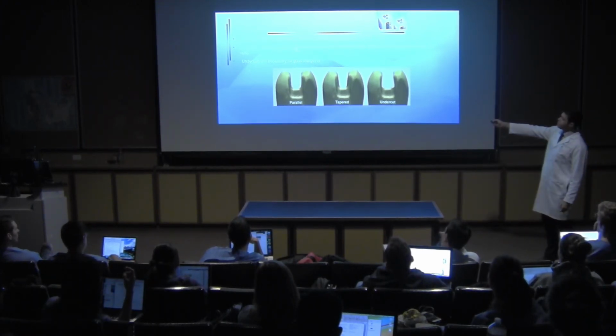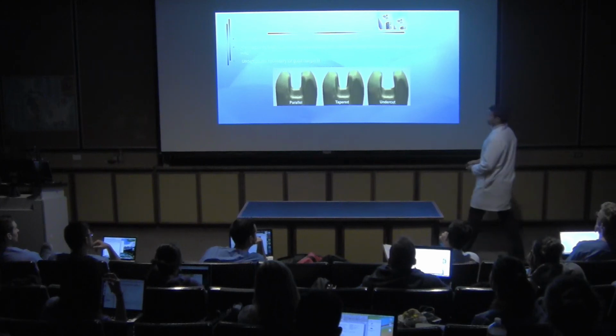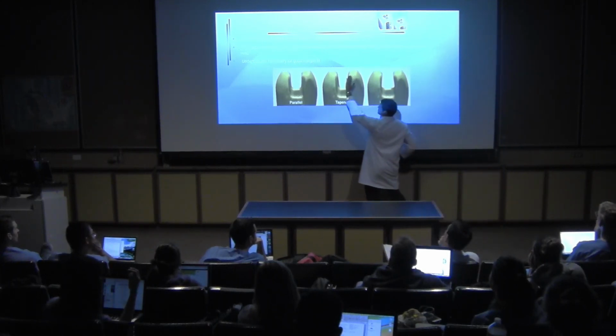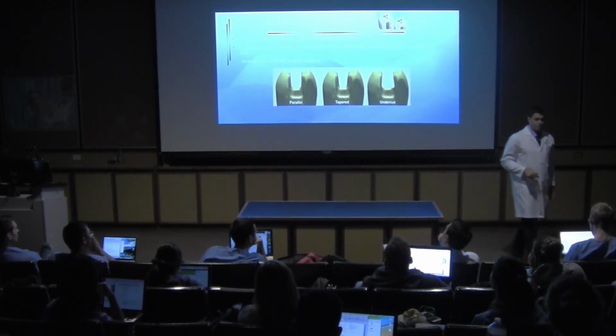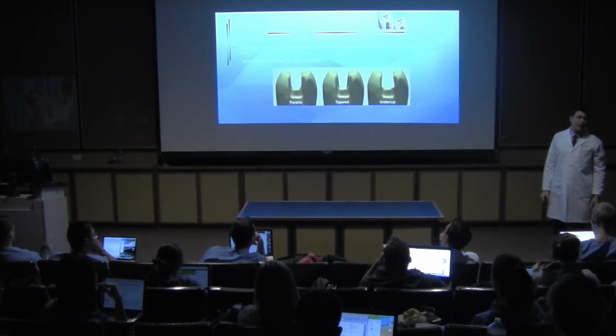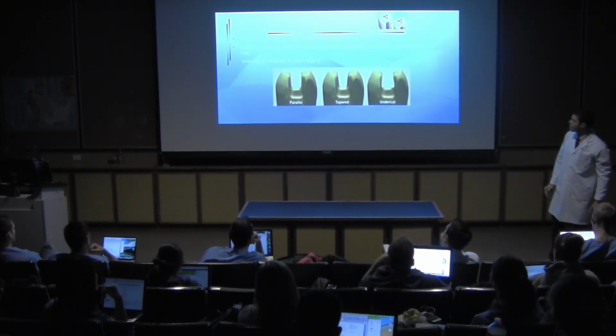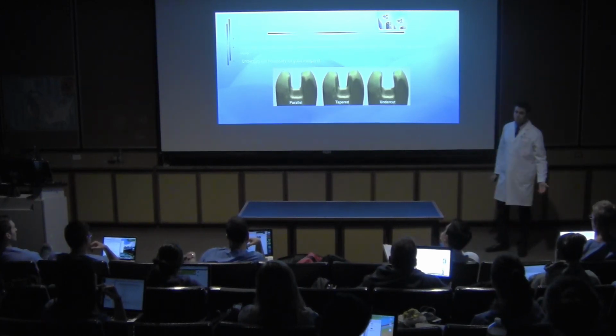Over-tapering leads to thinner occlusal margins and increased margin stress as the margin approaches the cusp. So we cannot over-taper too because we will have thinner margins on the ceramic. Keep the 6 to 8 degrees in mind. And again, undercut is not necessary for a good margin.